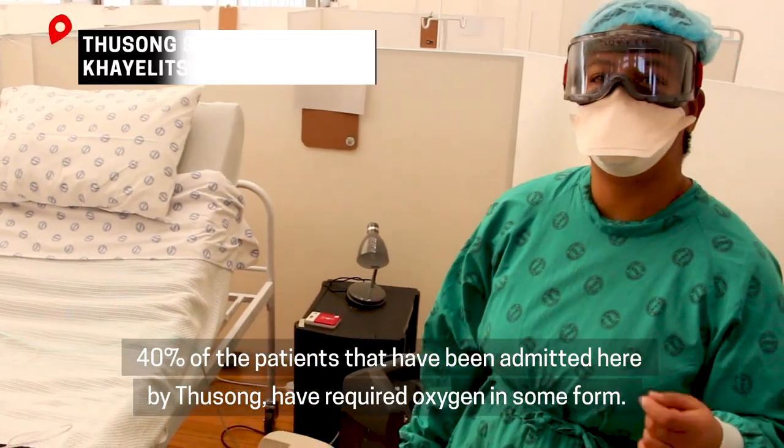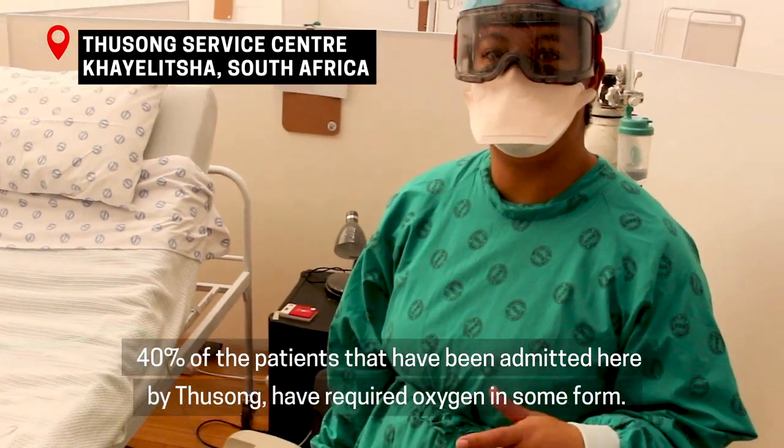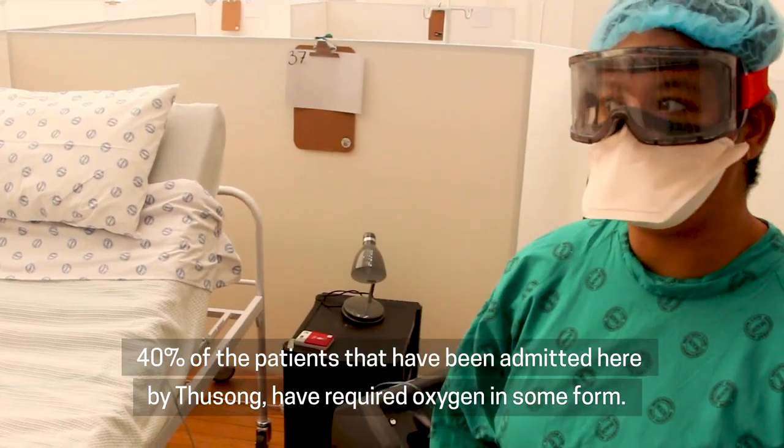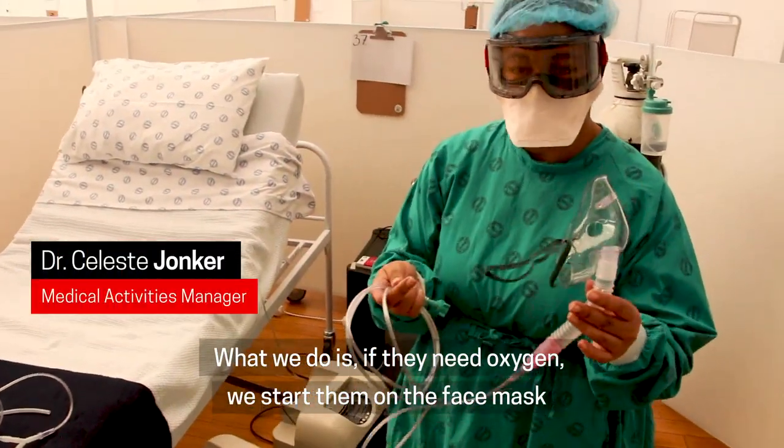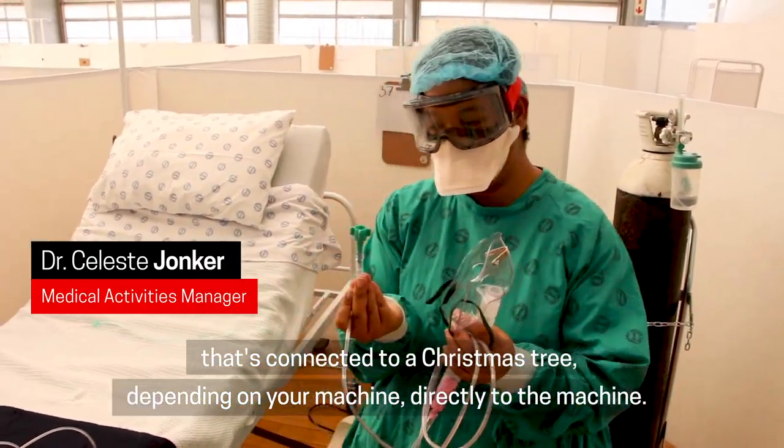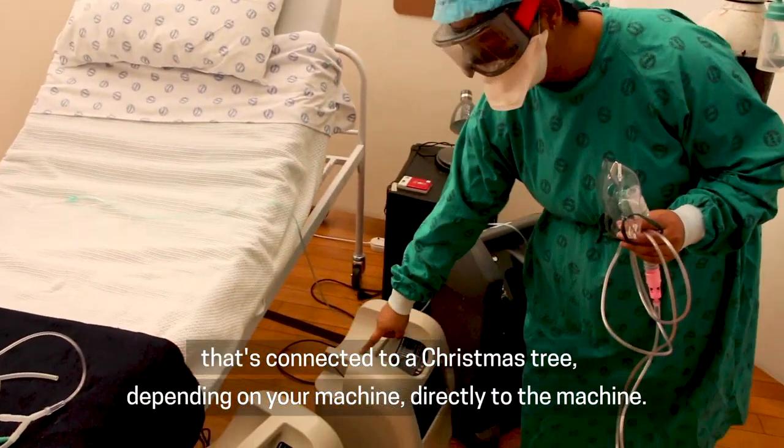40% of the patients that have been admitted here by Thusong have required oxygen in some form. What we do is if they need oxygen, start them on the face mask that's connected to a Christmas tree, depending on your machine, directly to the machine.